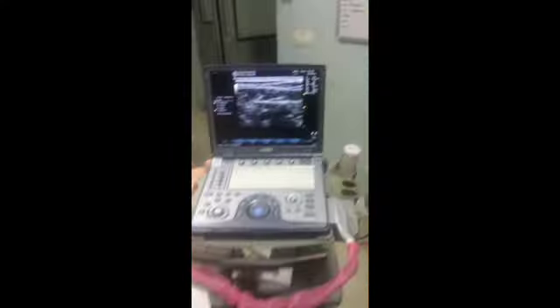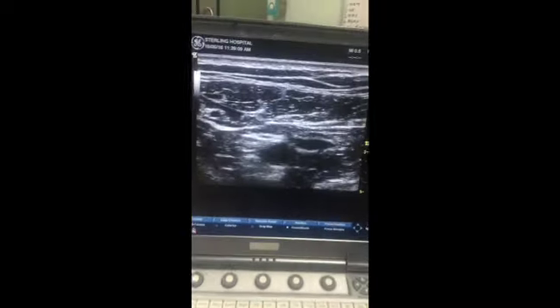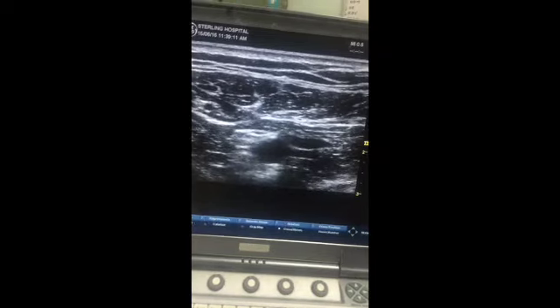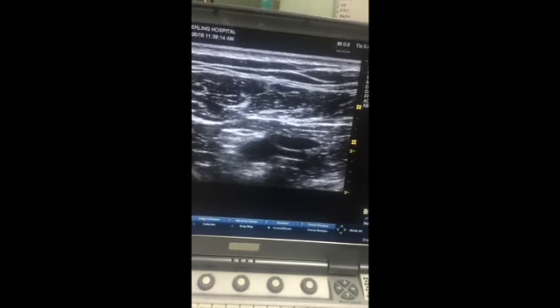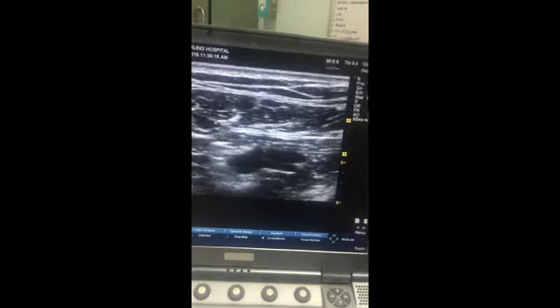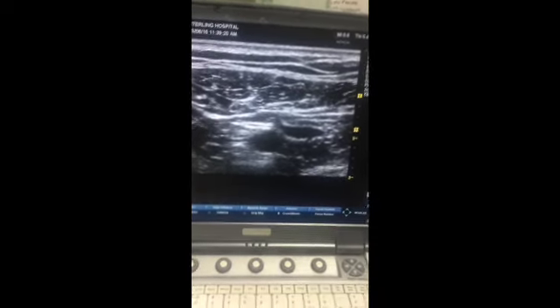This is the position for the infraclavicular block. The probe is positioned just below the clavicle, coming from lateral to medial side. In the ultrasound image you can see the axillary subclavian artery and vein, and the artery is surrounded by the cords of the brachial plexus.